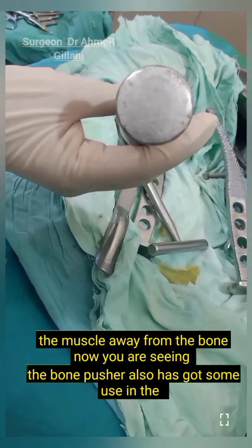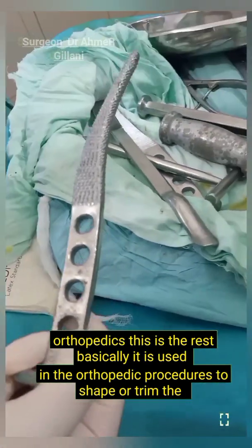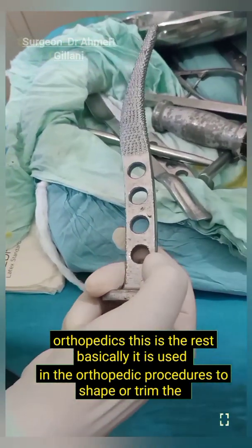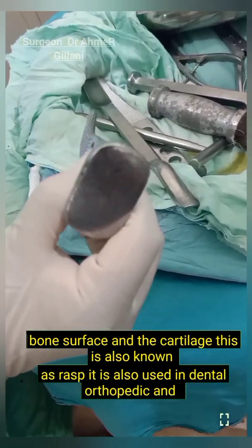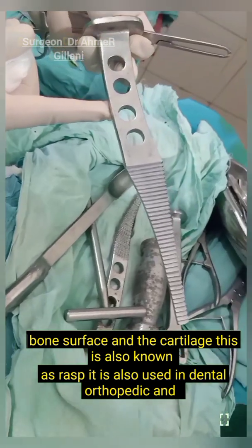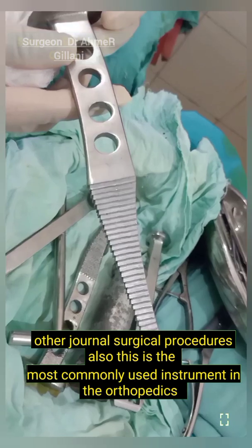Now you are seeing the bone pusher, which also has some use in orthopedics. This is the rasp. It is used in orthopedic procedures to shape or trim the bone surface and cartilage. It is also used in dental, orthopedic, and other general surgical procedures.